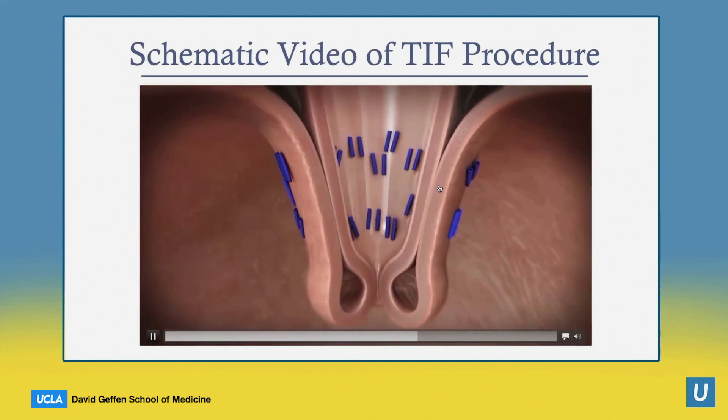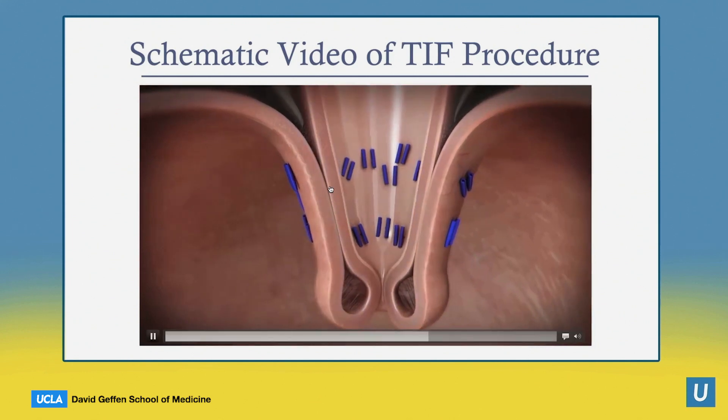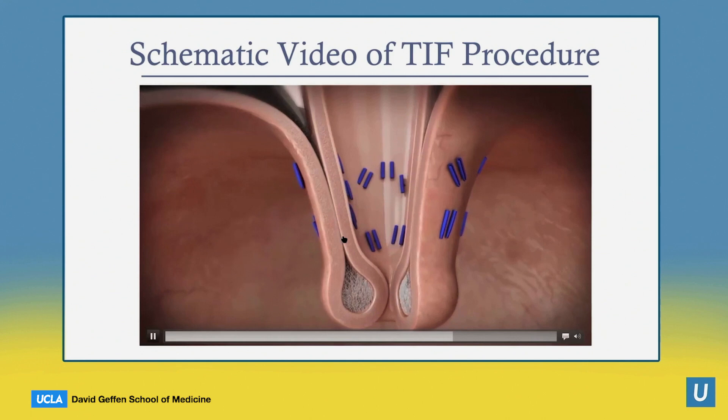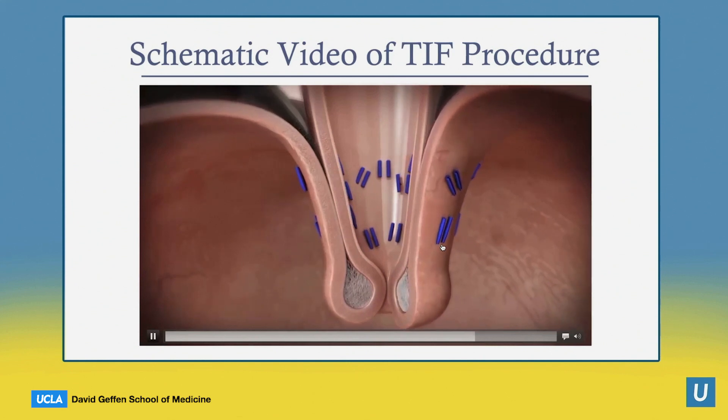You can see somewhere between 20 and 30 fasteners having been placed. These are called serosa fasteners because the idea is that the serosa of the stomach and esophagus fuse together, and that fusion is what creates the long-term durability of this procedure. This is the mechanism for the creation of this valve.